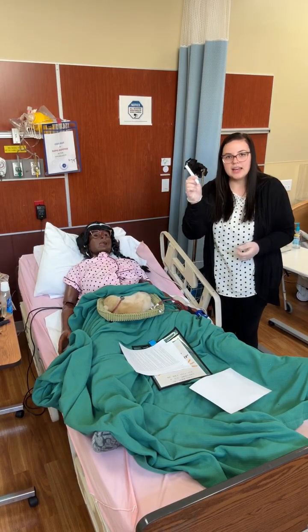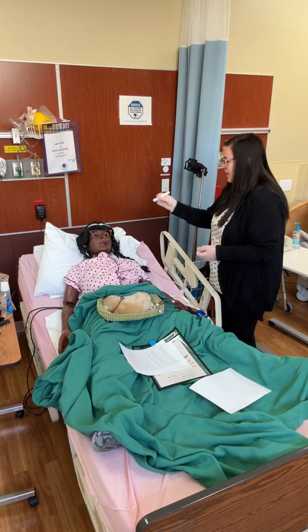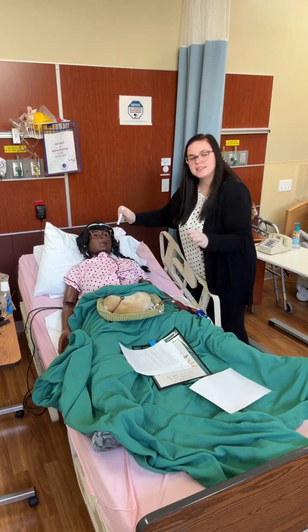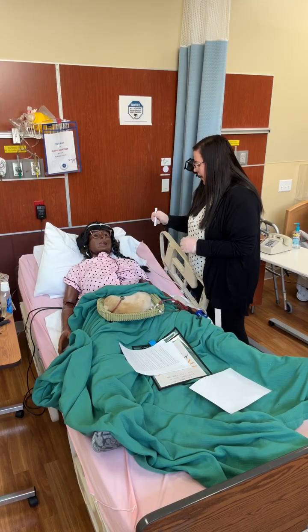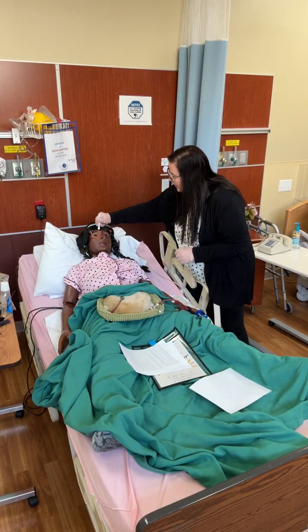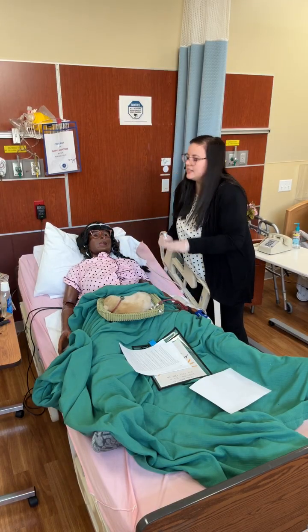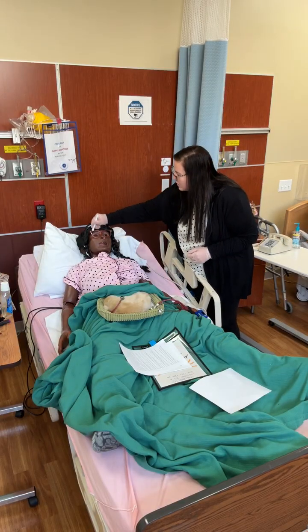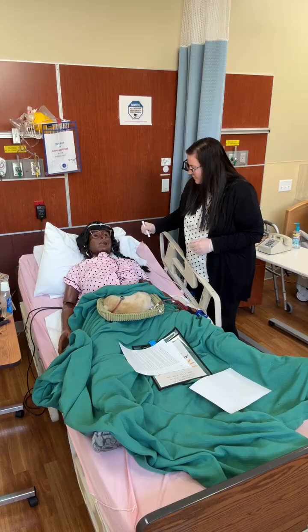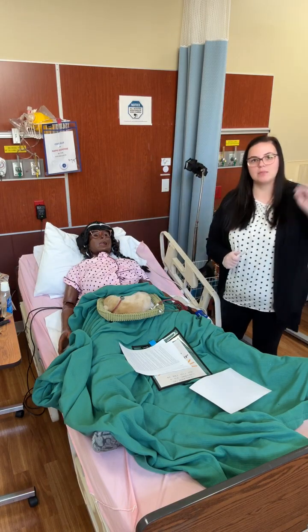There is also a pen light in this cart if you wanted to assess pupils. Like I said, Carla, or the simulator, does not have functioning eyes. So you will just flash the light and then say sim question, what do I see for my pupils? And we will tell you. Pupils are equal and reactive bilaterally. Perfect. Good. And then you're going to document all that on the whiteboard.